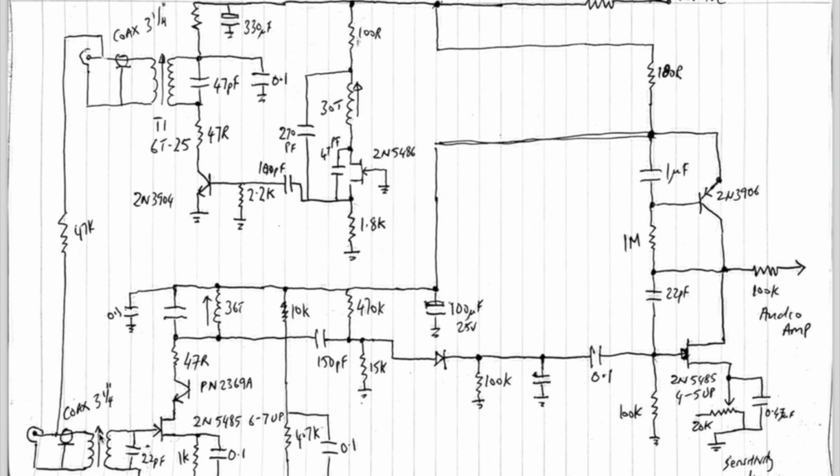And again, you've got a tuned circuit here, which picks up the Doppler shifted frequencies, which goes to the gate of the 2N5485, and then you've got a tuned circuit here. That's about 22 pF, as far as I can remember. And again, similarly, I think the inductance was about 5 microhenries, not far off from there.